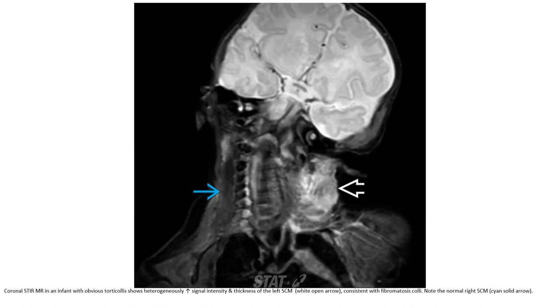MRI in an infant with obvious torticollis demonstrates heterogeneously increased signal intensity and enlargement of the left sternocleidomastoid muscle, consistent with fibromatosis colli, with a normal right sternocleidomastoid muscle for comparison.